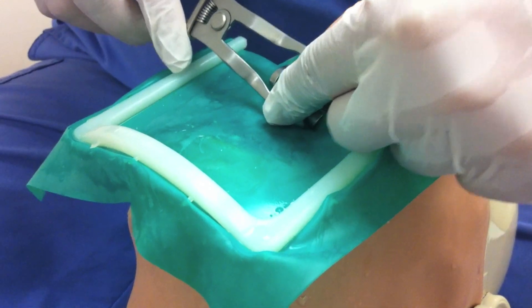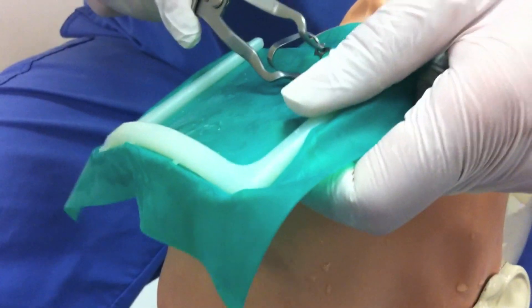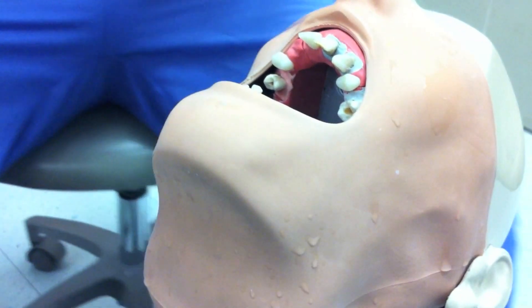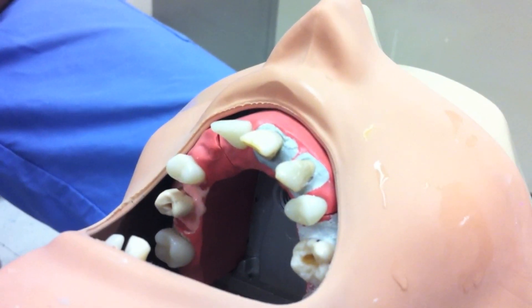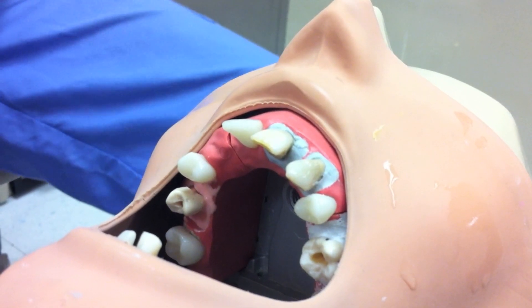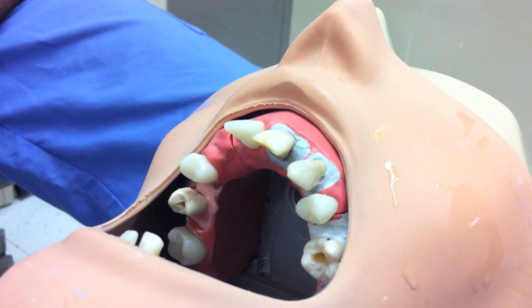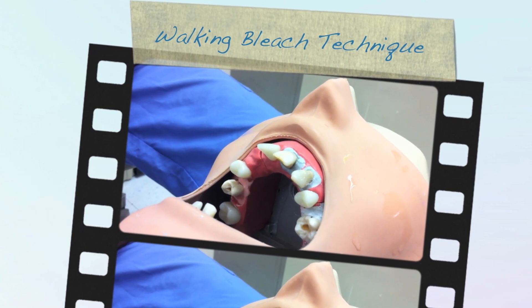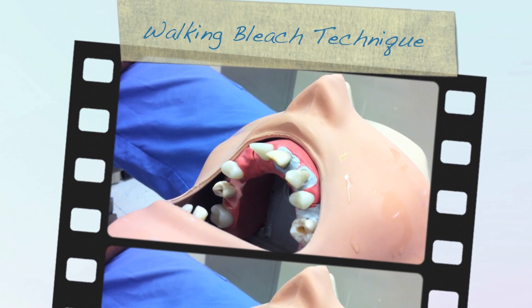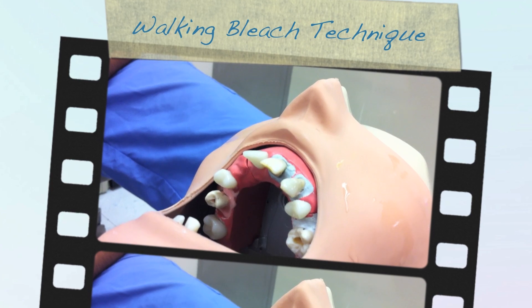The rubber dam is removed. The patient is informed that the bleaching agent works slowly and that significant lightening may not be evident for two or more weeks. It is common to see no change initially, but dramatic results occur in successive days or weeks or after a future application.